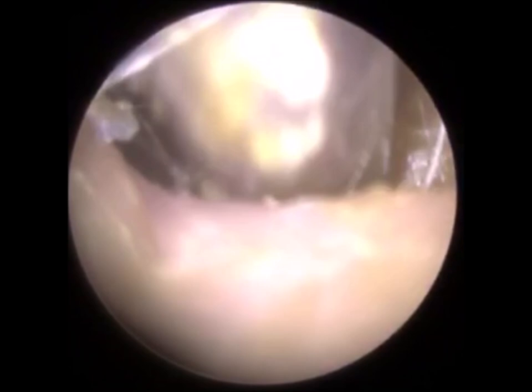we've done our job. Just showing again, just trying to remove a bit more keratin of this crater. You can see it there. We're not trying to remove every single last bit. This procedure's gone on quite a long time already. Just some bleeding there, just vacuuming that. So that's that cave, that crater, caused by his mastoid surgery.